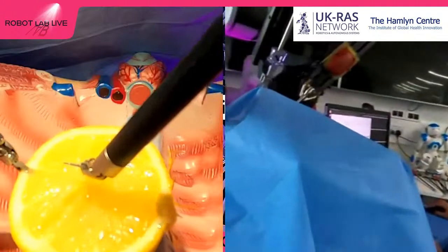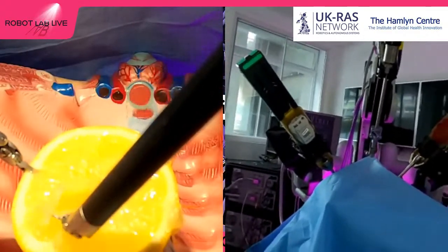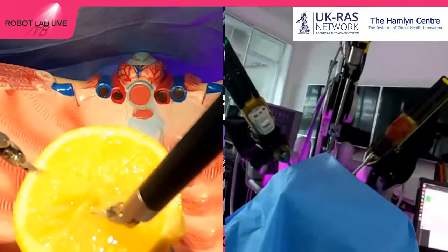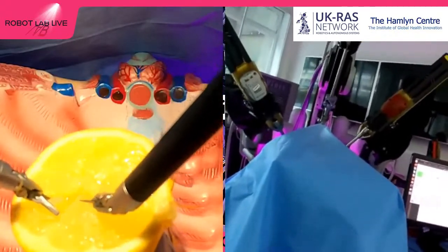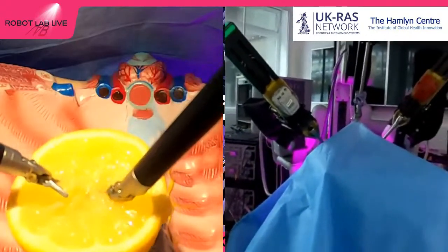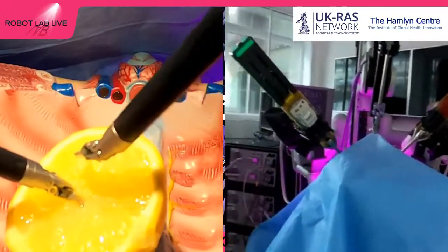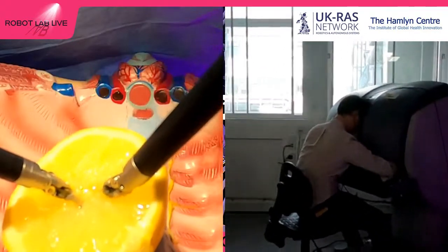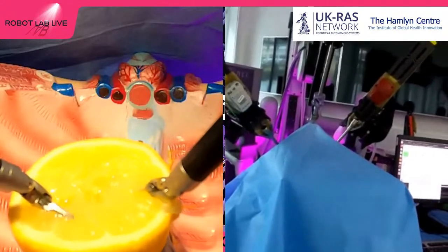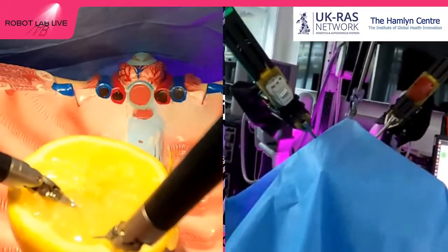And lately, another piece of research that we do in the center is, as you can see, all these tools are very stiff, right? But if you look at your hands and think of a surgeon's hands, they are soft and they are compliant, and they're gentle with the tissue, or at least I hope that they are gentle when they perform surgery on us. But these ones are stiff and they are not compliant, and so our researchers, especially Sam, who is now in the image, are doing amazing work and research in creating soft devices driven by pneumatics that can do as the surgeon's hands.